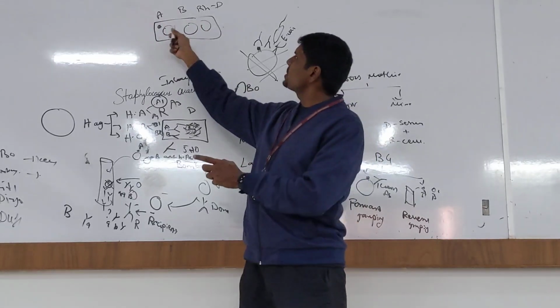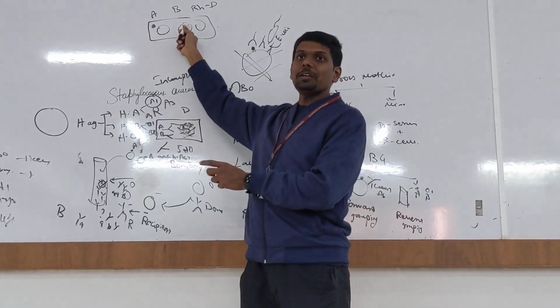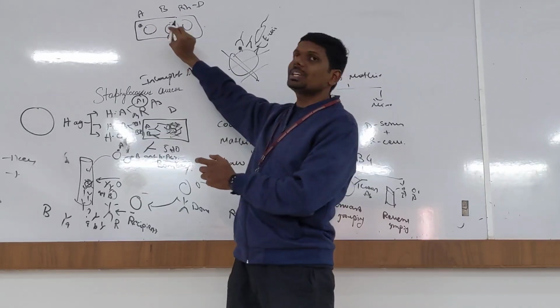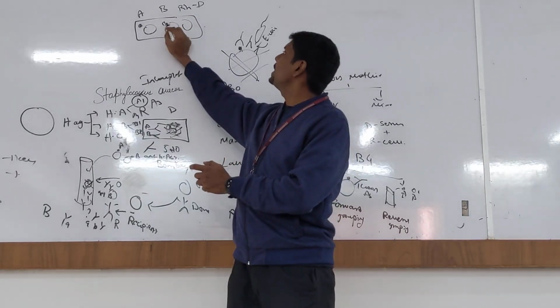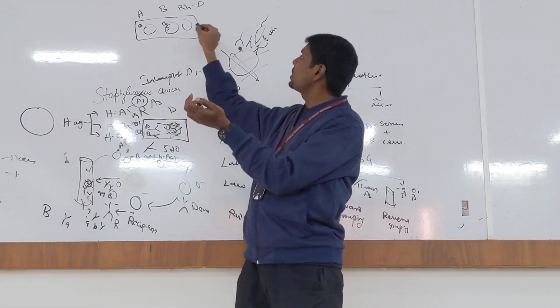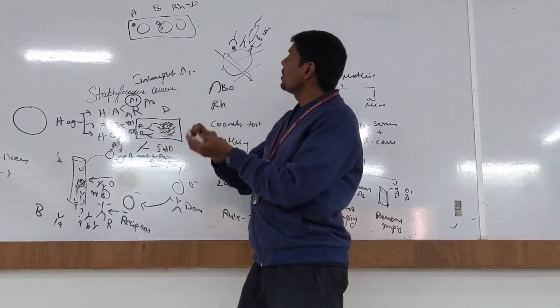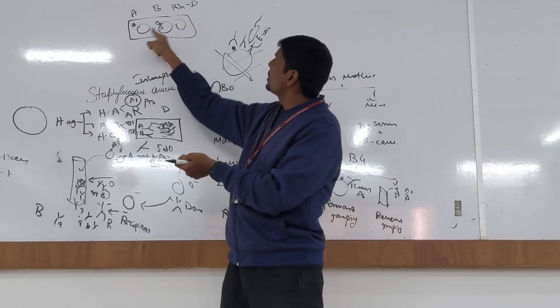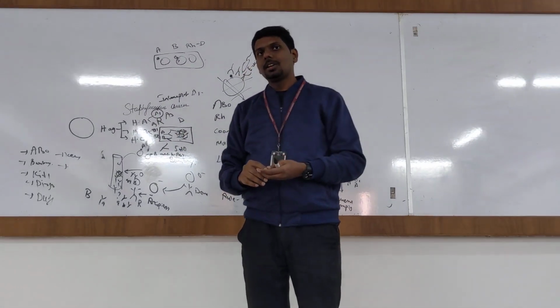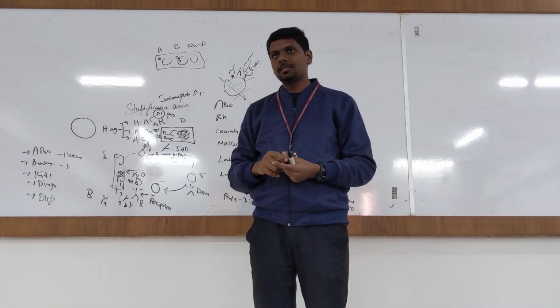If I use the same stick here, I would be contaminating B with A antibodies. I should use the other side of the stick to mix the B antibodies, then a new mixing stick for the third one. If you forget, or if the drops get mixed together while shaking, you will get wrong results. So that is analytical error.